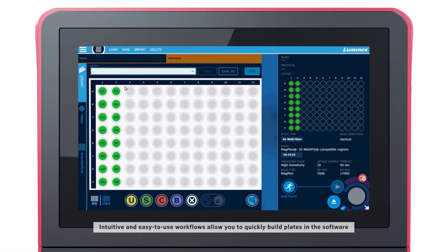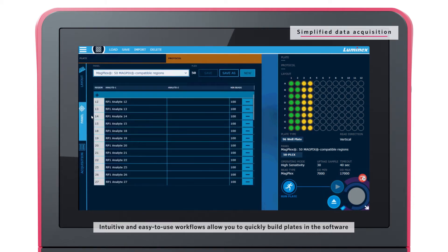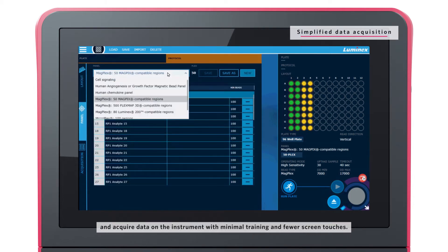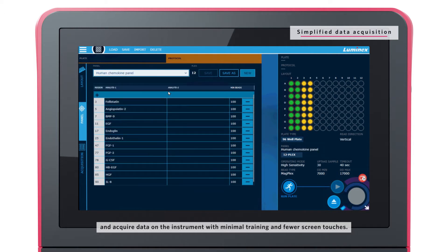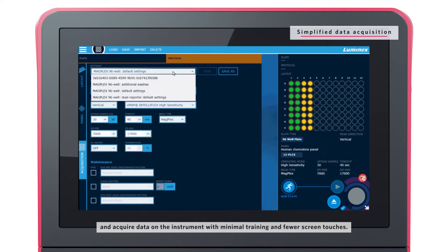Intuitive and easy-to-use workflows allow you to quickly build plates in the software and acquire data on the instrument with minimal training and fewer screen touches.